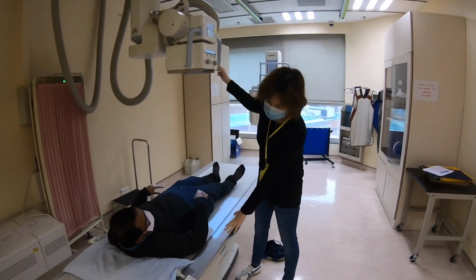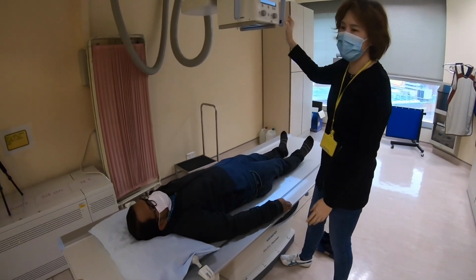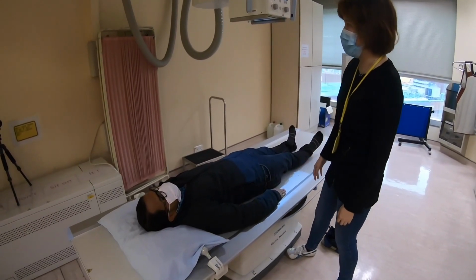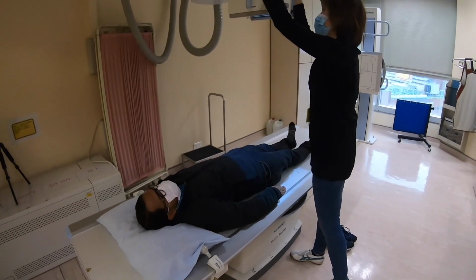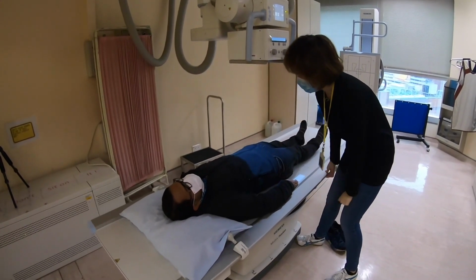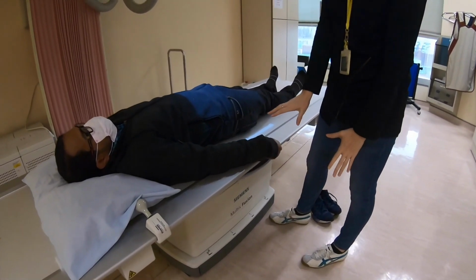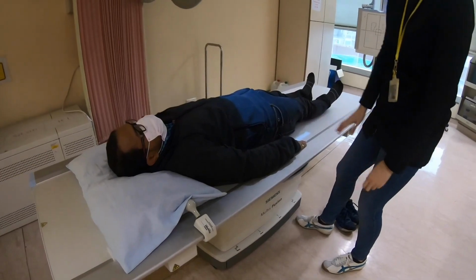So whenever you try to move the couch, make sure that his hand is not on the edge of the couch, because there is an incident that the radiographer made the patient's hand fracture without paying attention when he moves the couch. So you can try to move the couch with his hand on the couch. Okay, like that, without grabbing. Okay, it's very dangerous if you move the couch while your patient's hand is holding at the edge. Okay, just always make sure that this is on the couch.